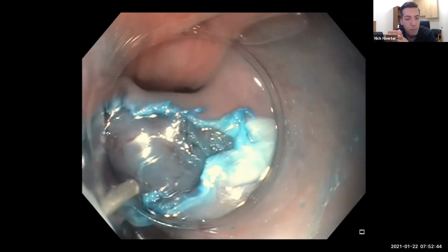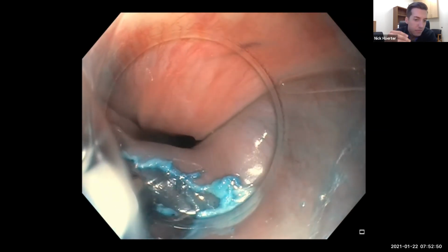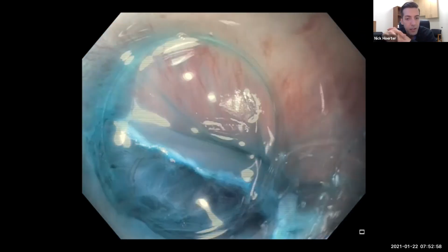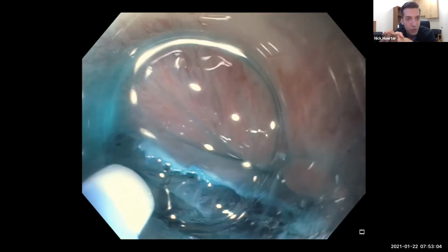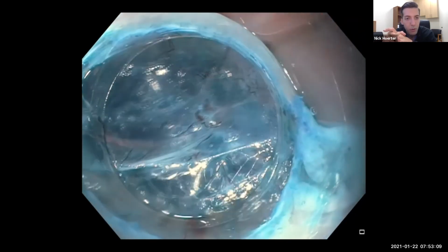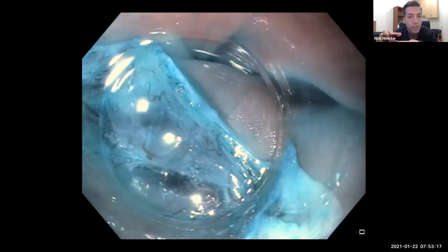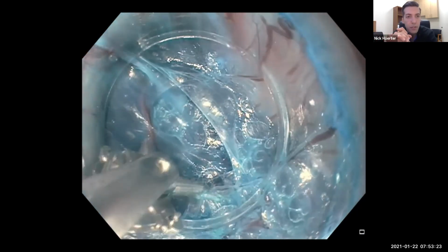So again, that septum's in the middle. That was a tunnel on the diverticular side, and now we're creating a tunnel on the esophageal side to carve out the muscle in the middle in order to allow us to dissect that safely. In any of these submucosal procedures, POEM, Z-POEM, you really want to preserve the mucosa, because ultimately that is what prevents you from having a full thickness perforation. We are dissecting all the submucosa, we're dissecting out the muscle, and so the only thing preventing you from being full thickness is that mucosal layer there, and ultimately closing clips.